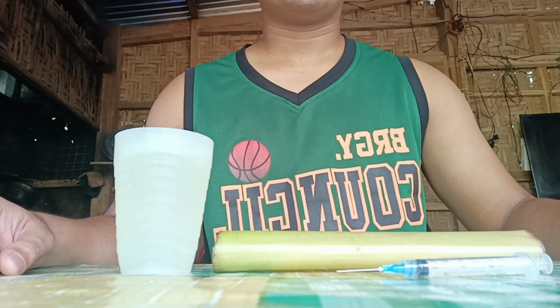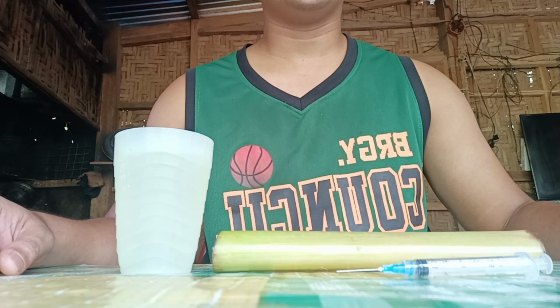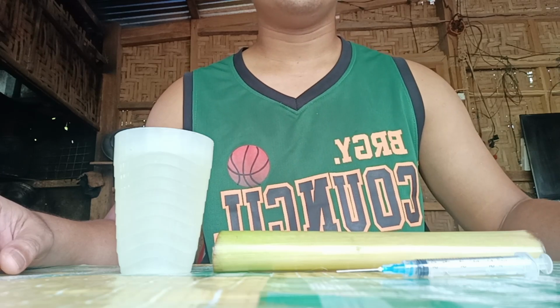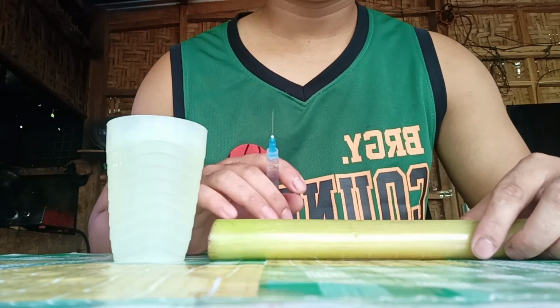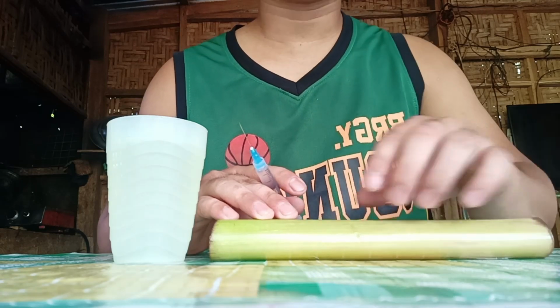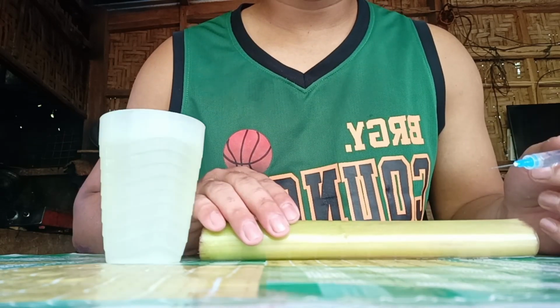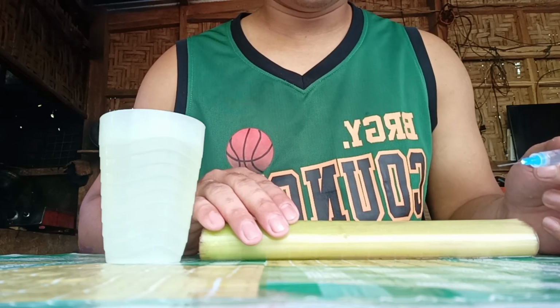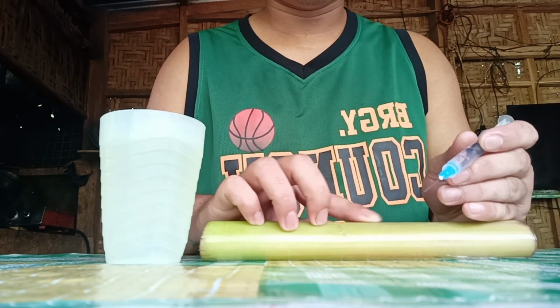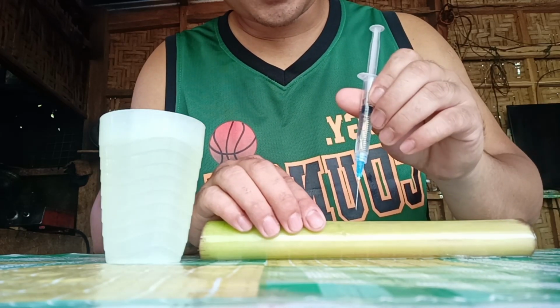At this moment, I am going to demonstrate to you how to inject properly using a particular angle. Just imagine that this banana stem is the site of the animal that we are going to inject. Be sure to massage the injection site before injecting, and then inject it at 90 degrees.